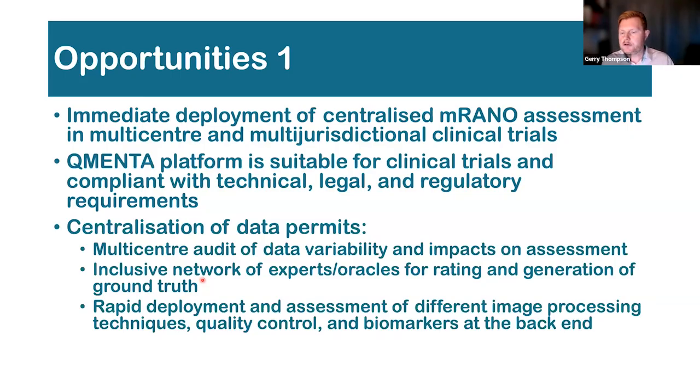You've now got an inclusive network of experts or oracles for rating. Rather than relying on one or two individuals at each site, you can have a dynamic group of engaged experts, and that also allows for things like test-retests or re-rating and scrutinization of ground truths, and rapid deployment and assessment of different image processing techniques. So if you want to test this, before you might have to work out a whole pathway end to end of getting the data, analyzing it, putting it back to the system, or you would have to install a local software function at every individual center.